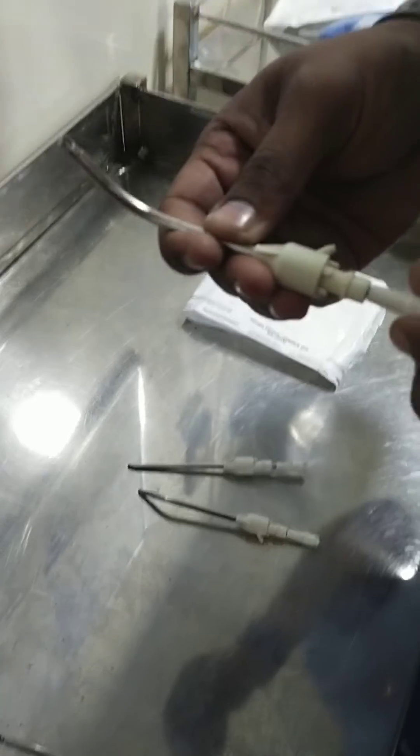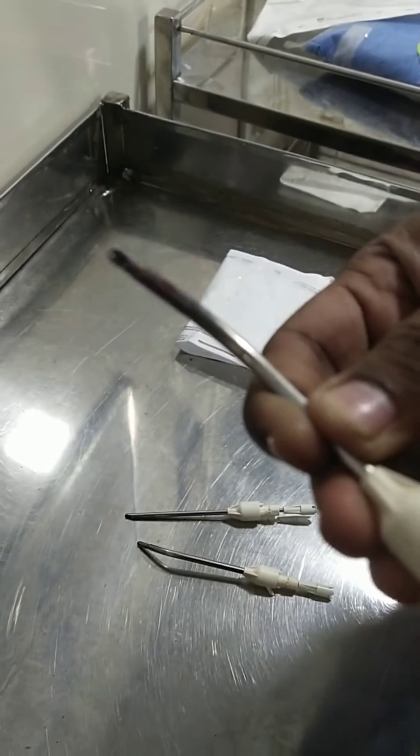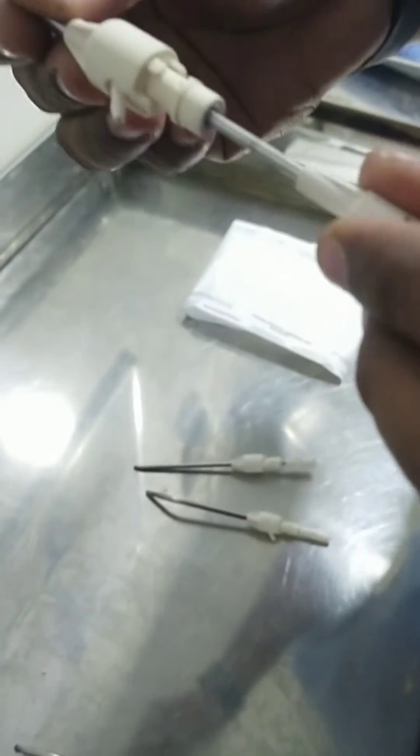Next thing — this is a 60 degree blade. Here when you rotate, the tip is not rotating — you can see it closely. I am rotating but it is not rotating at all. This is because inside the stem got damaged.